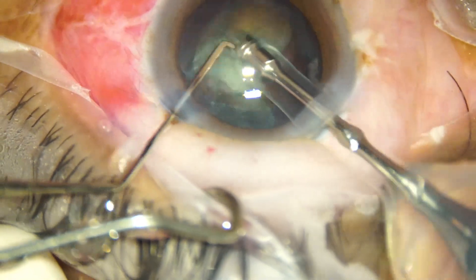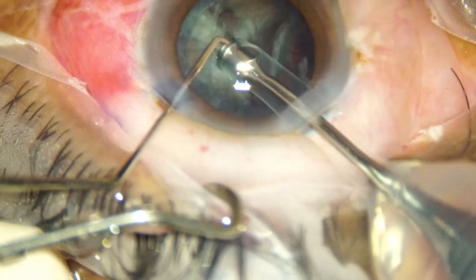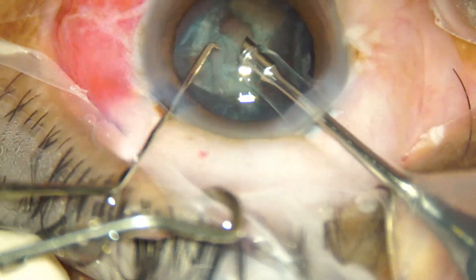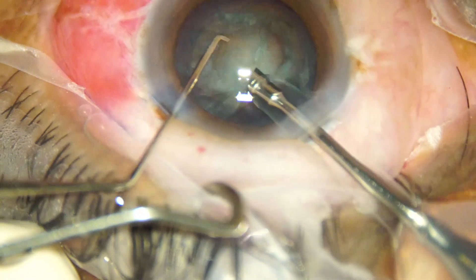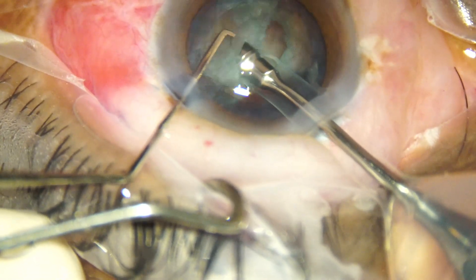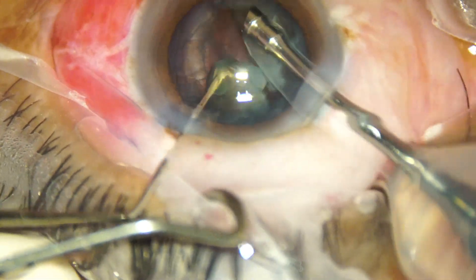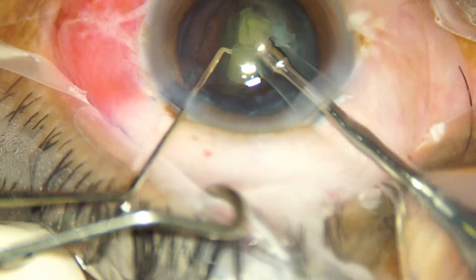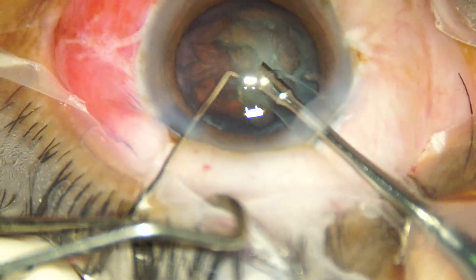Here she could not keep the hold and she has eaten up the matter in front. So she turns the nucleus, holds it again, and very gently with adequate vacuum she holds and starts emulsifying these pieces.